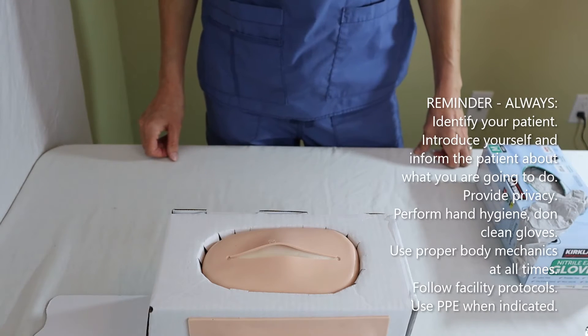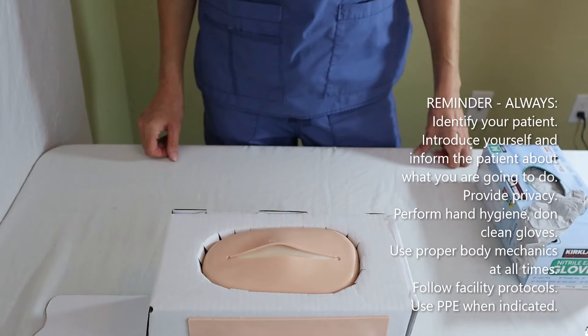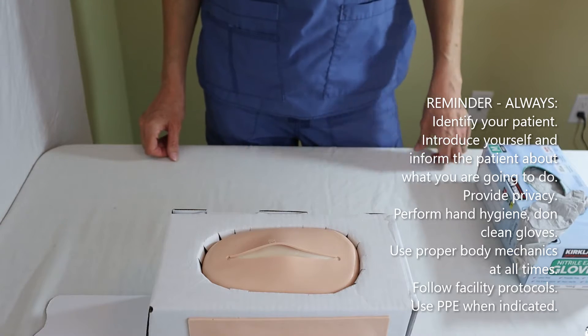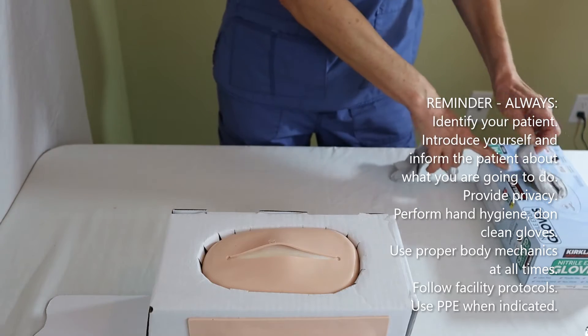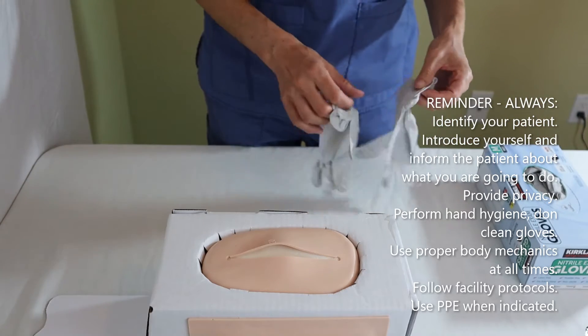The application of SteriStrips is a clean, not a sterile procedure. In this case, the sutures or staples have already been removed.